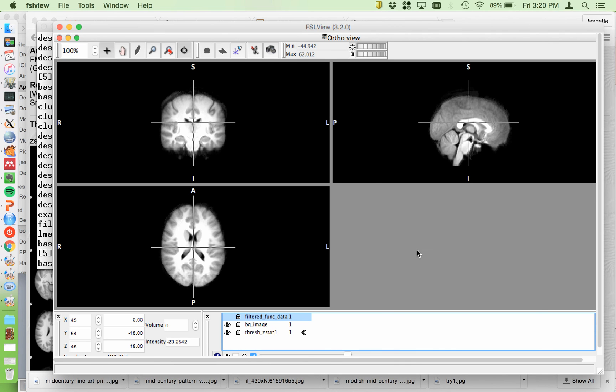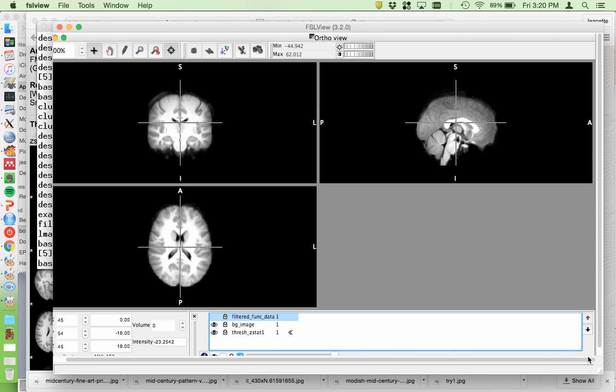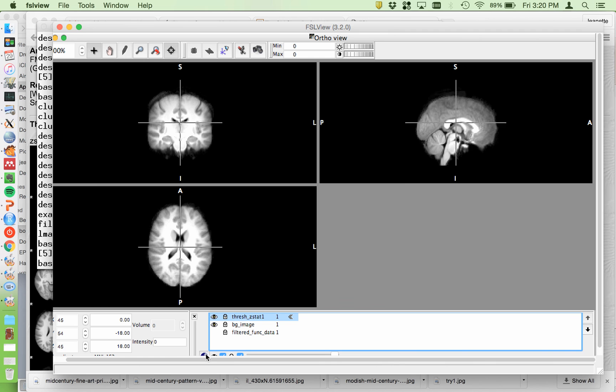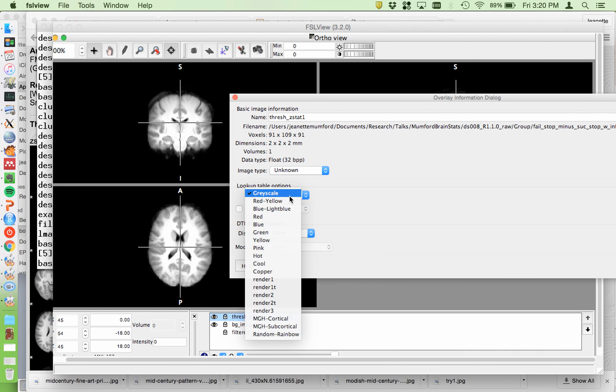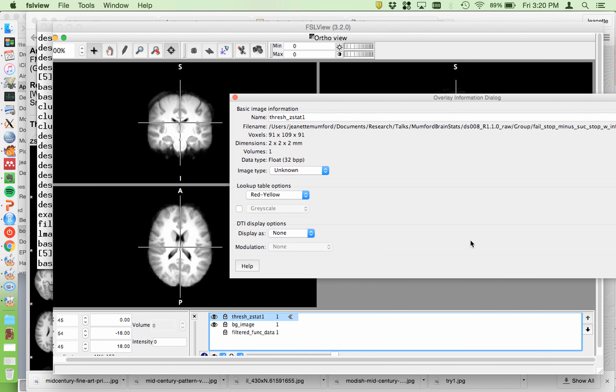And I always move it, oops, the thresh zstat on top. And then you would typically make it red so you can see the activation in it.